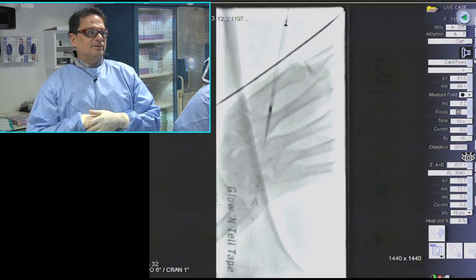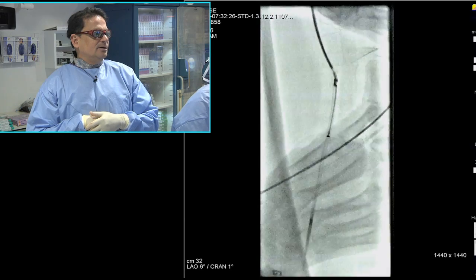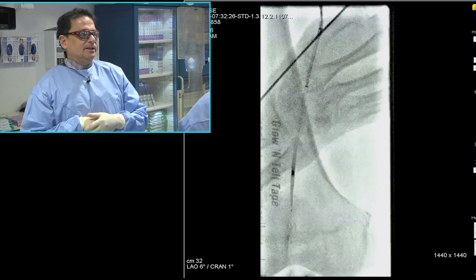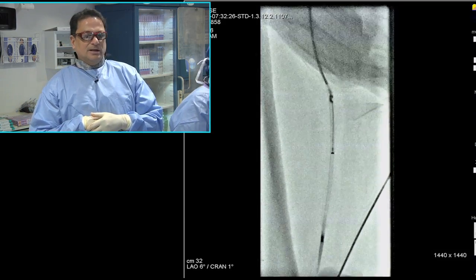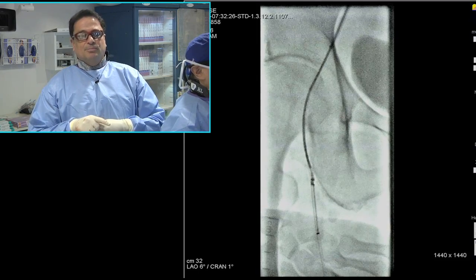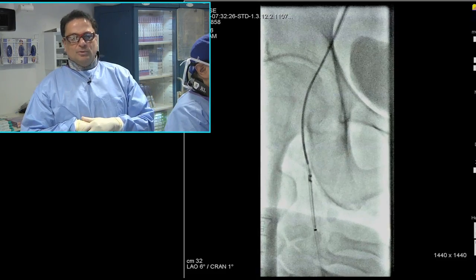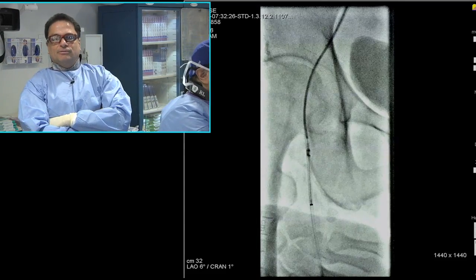Now, the technique of atherectomy is important. As you can see, they've chosen a very long atherectomy device here. Is it crossing that or no? Push the filter slowly. There's nothing in the filter. More. Now, don't try this technique at home. You don't want to do that. But this is something we use a lot, in a lot of different cases with a lot of different products, so we're pretty experienced, and we can show you that that can be pushed. That filter can be pushed while the other filter from Medtronic cannot, because it's attached to the wire. This one is independent of the wire, so if you push it along with the wire, it will go forward. So now we're going to do the atherectomy, and Sachin is going to do a 4-quadrant cut here.